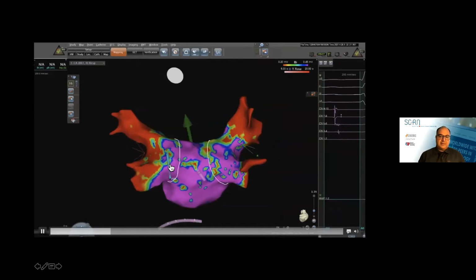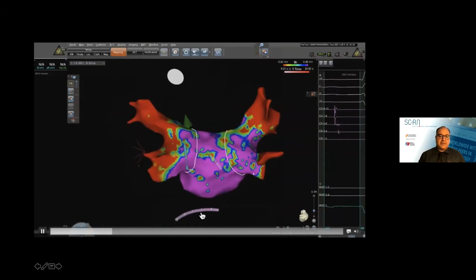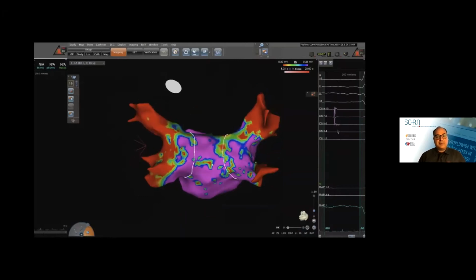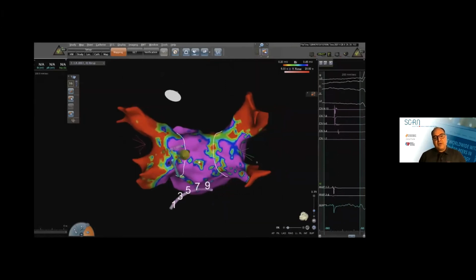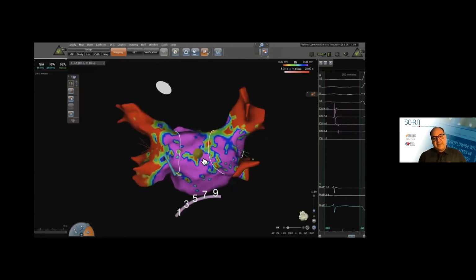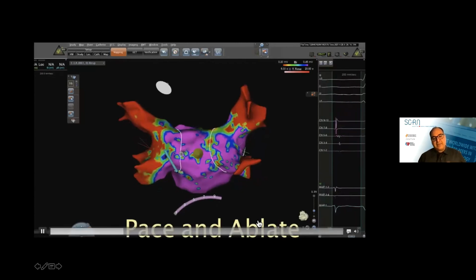So this catheter here is essentially a quad catheter attached to the esophagus, and we can see exactly where it is located. We can continue looking at it during the procedure if it moves up or down, or we can intentionally move it up and down. The magnets now come out, the ablation catheter is in place.